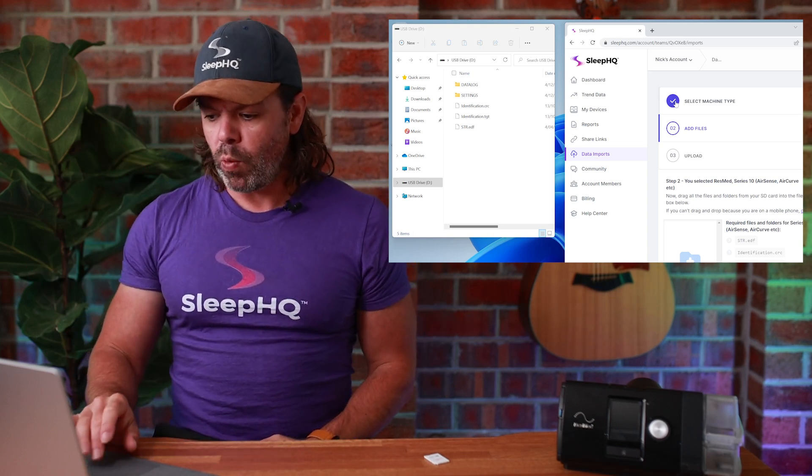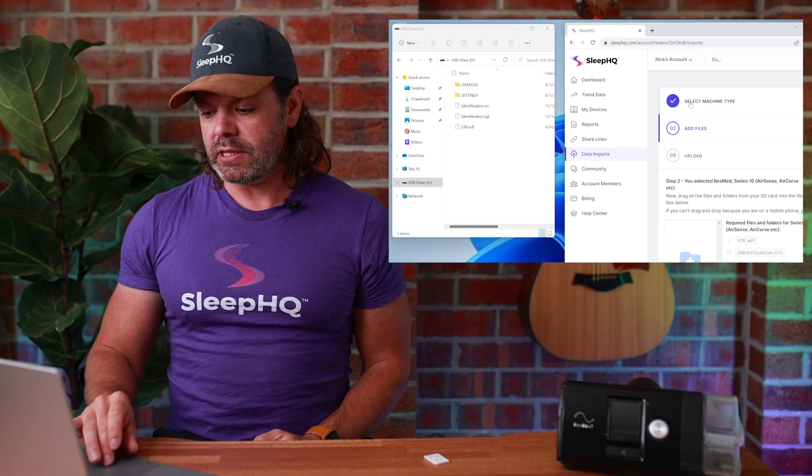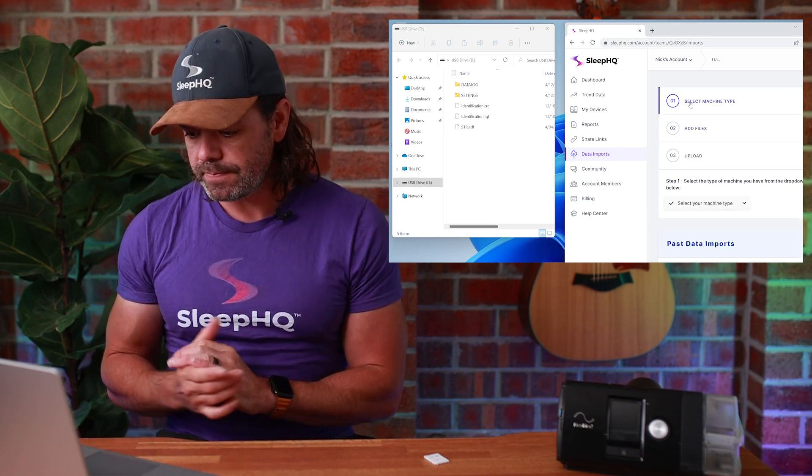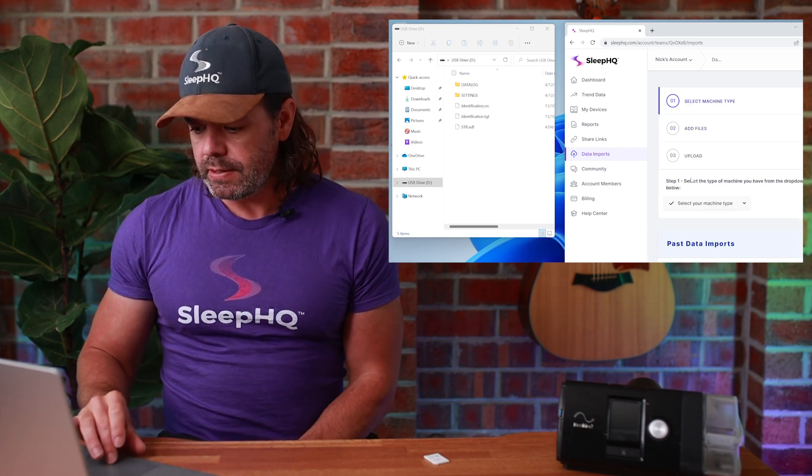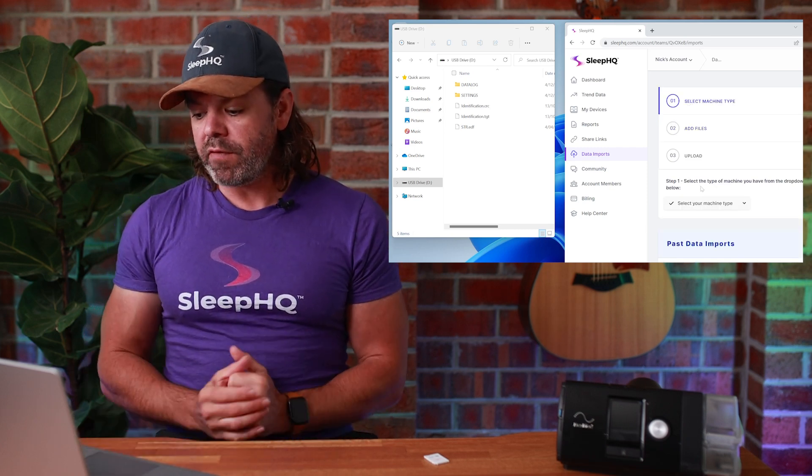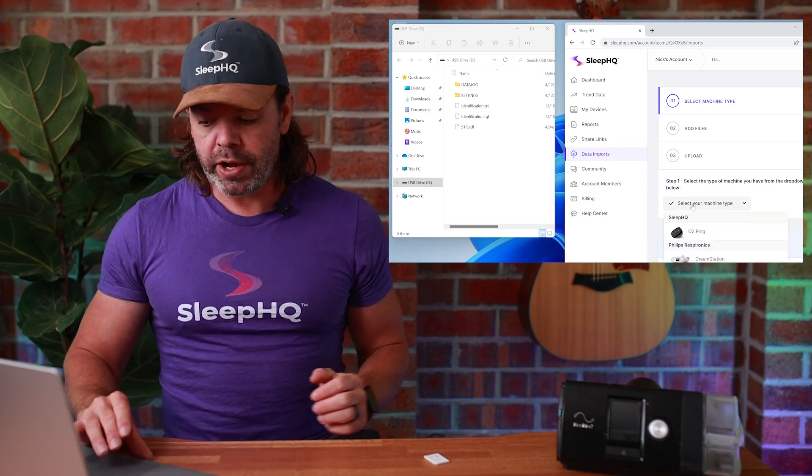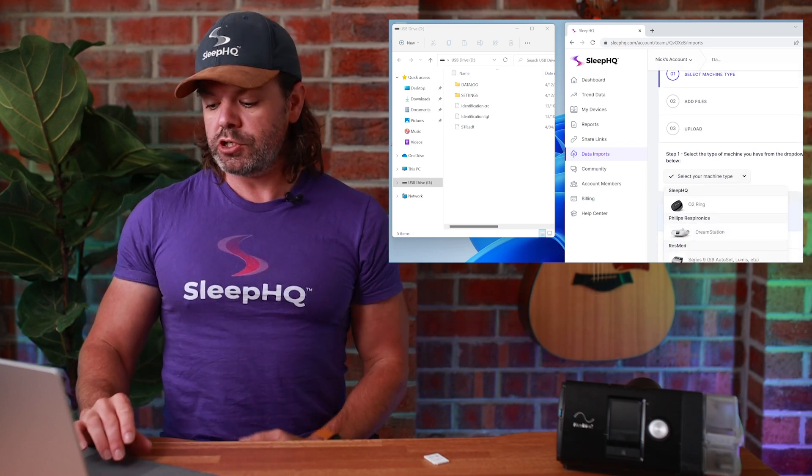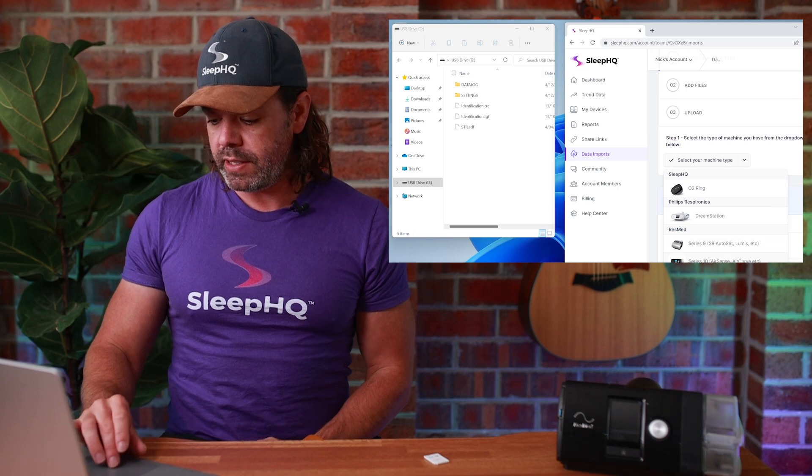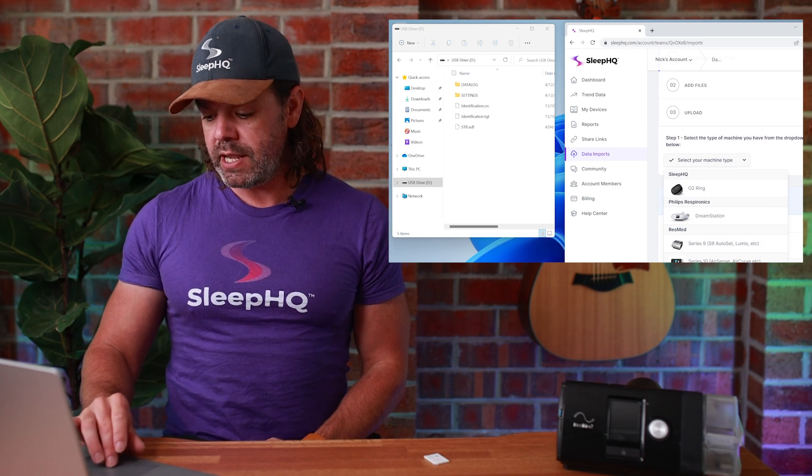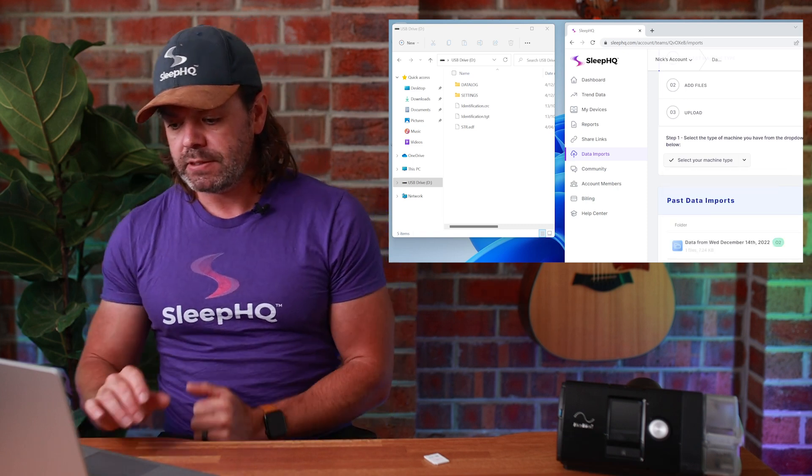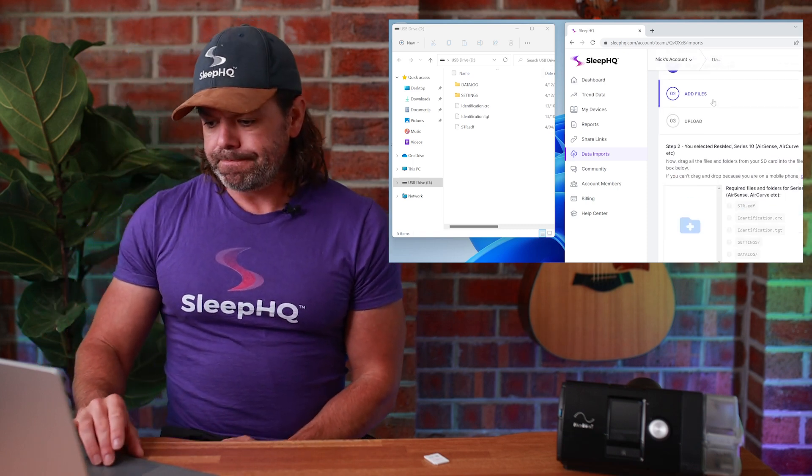So step one, select Machine Type. Let's click that. Select the type of machine you have from the drop-down list below. Now I know I've got an AirSense 10 here, so you just need to choose whatever machine you have. Series 10 AirSense, there's mine.